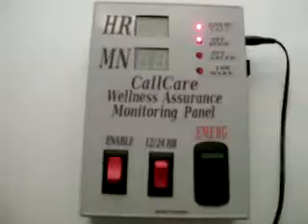I'm going to disconnect my phone line connection here because my 2 designated contacts are my 2 sisters, and I don't want them to think that I have an emergency situation that they should have to deal with. Here is the sound that your emergency contact will hear.